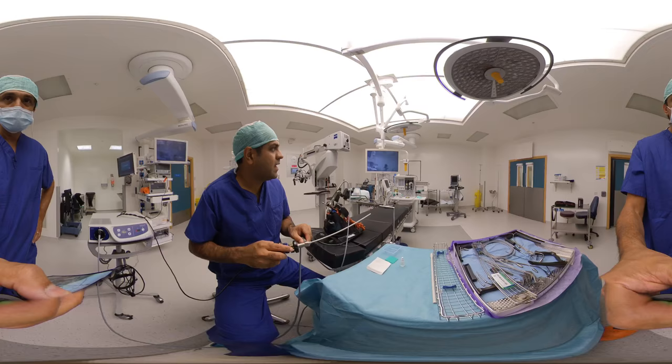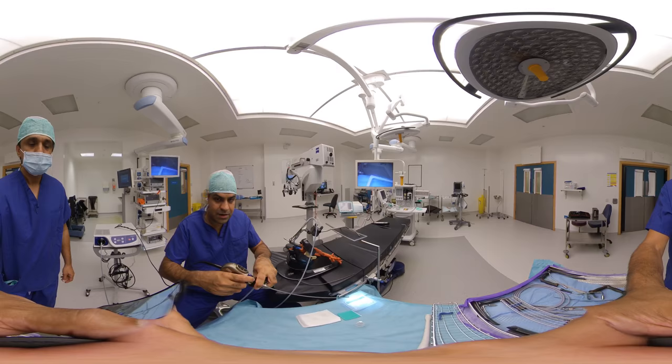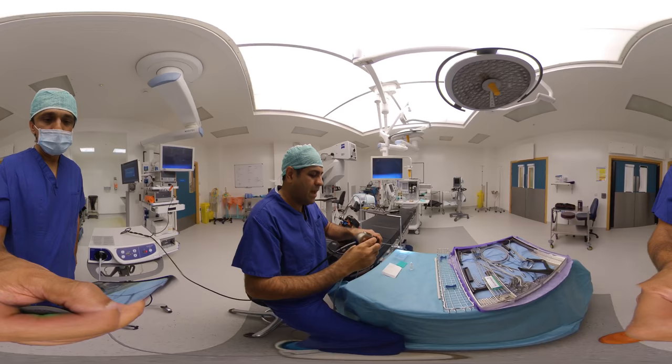If you have a look up at our screen, on my handle piece there are different dials, and this changes things. So if you come back to about here, on my handle piece there are different dials here, and this changes.